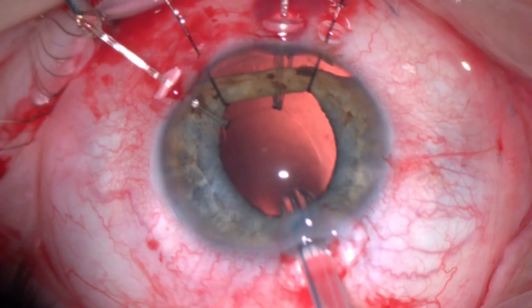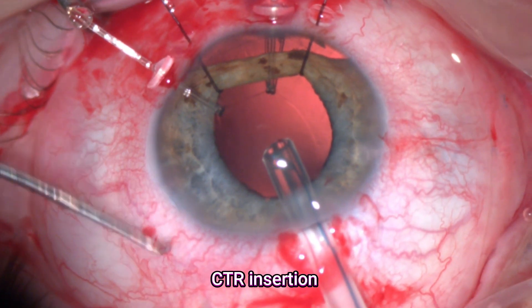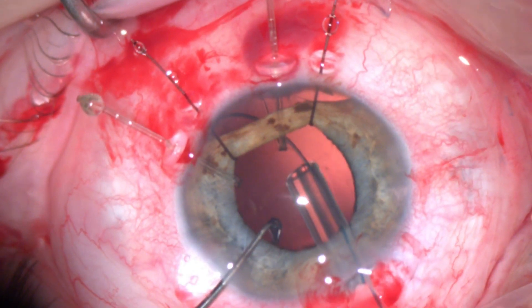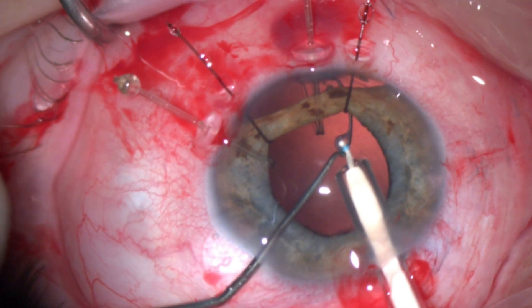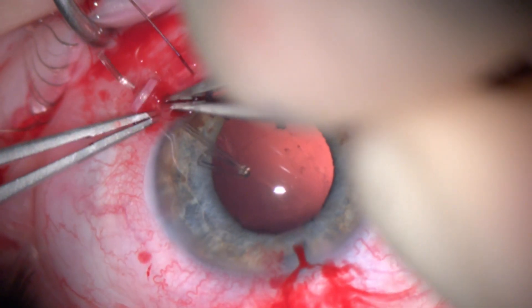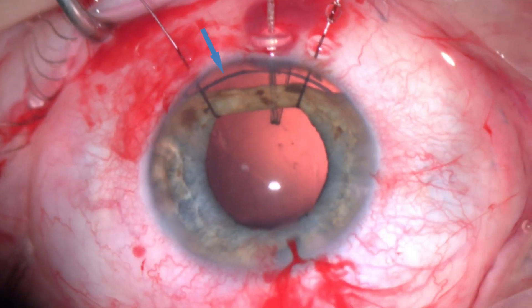I slightly extended the main incision and decided to put a capsular tension ring. In that situation I prefer to insert it guided with a second instrument to avoid any stress on the already weak zonules. You can see the capsular tension ring nicely supporting the capsular bag. You can see it through that iris defect.